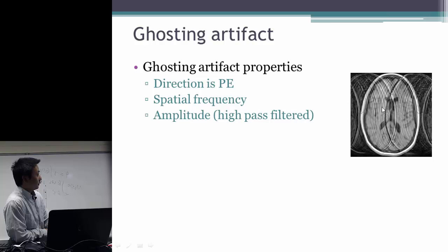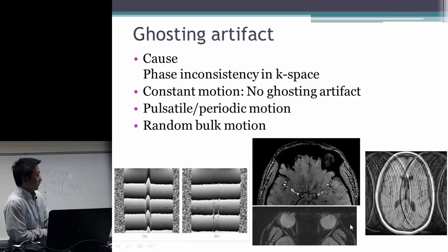Whenever you see a ghosting artifact and its direction, you can immediately tell which direction is the phase encoding direction.